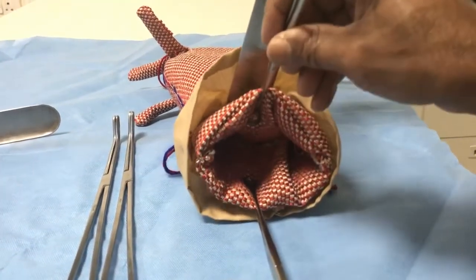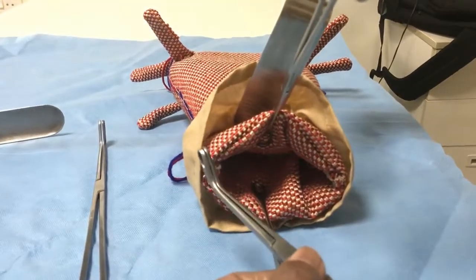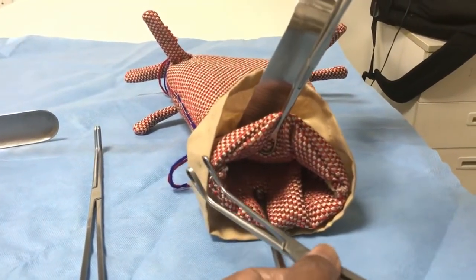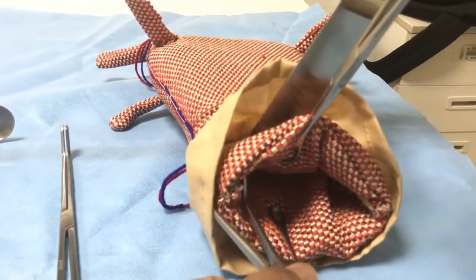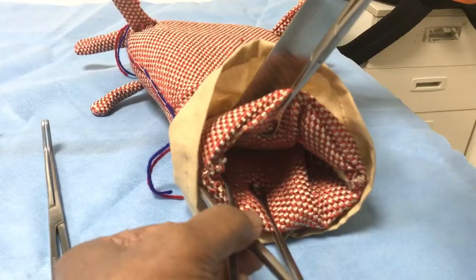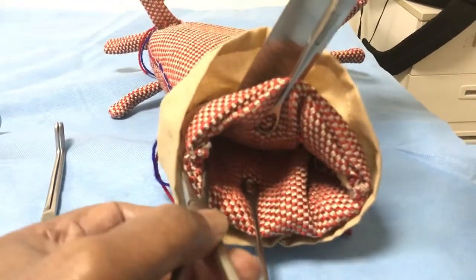Once the cervical canal is opened, take the right-angled transvaginal uterine artery clamp. Insert one blade into the cervical canal and the other lateral to it, and let it go up until it is prevented from going further by the lateral fornix.